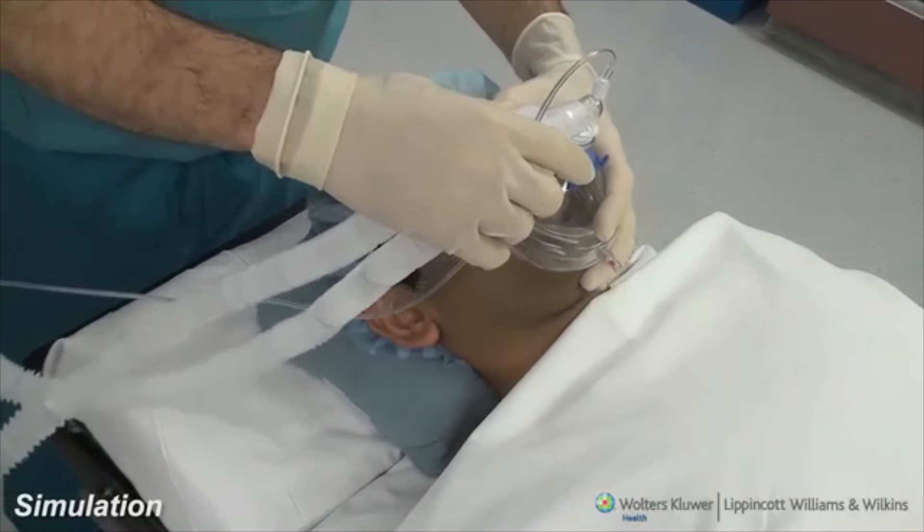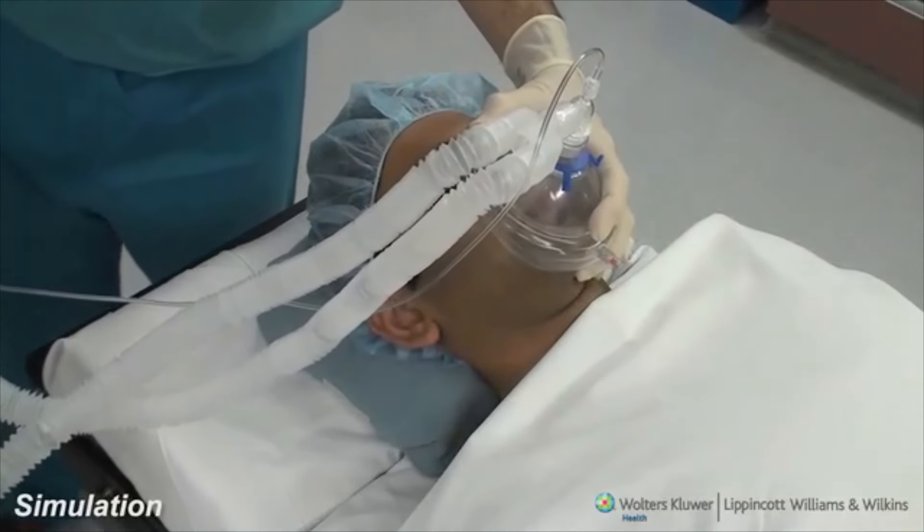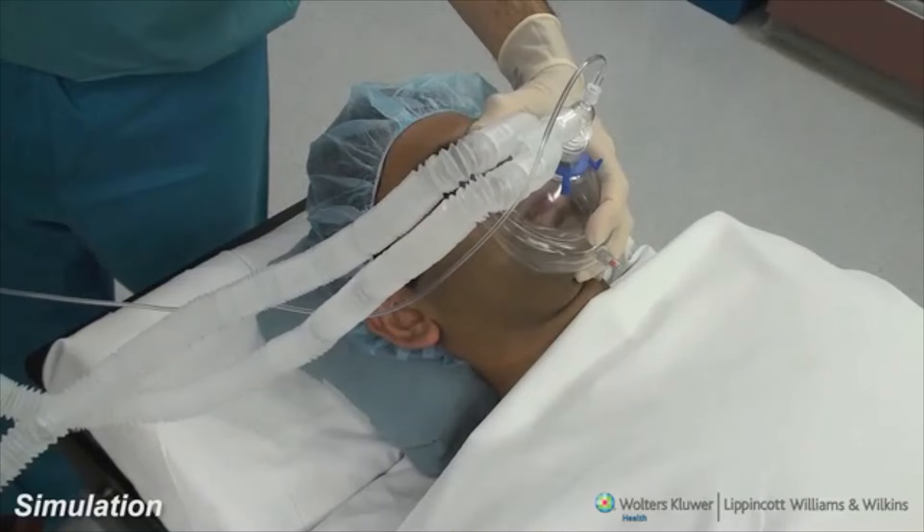This simulation illustrates four possible errors during pre-oxygenation before the induction of general anesthesia.